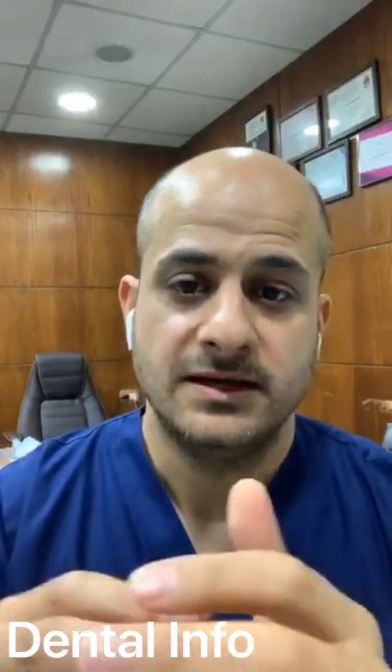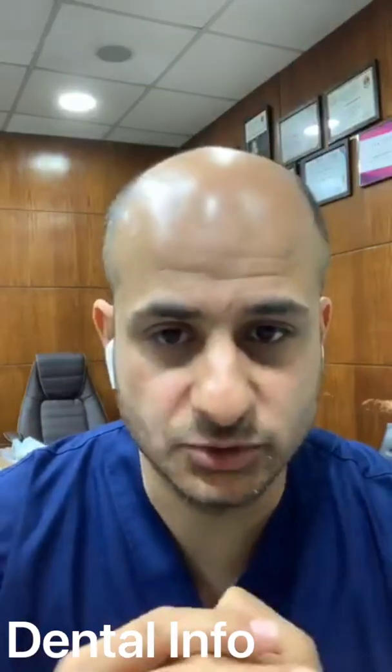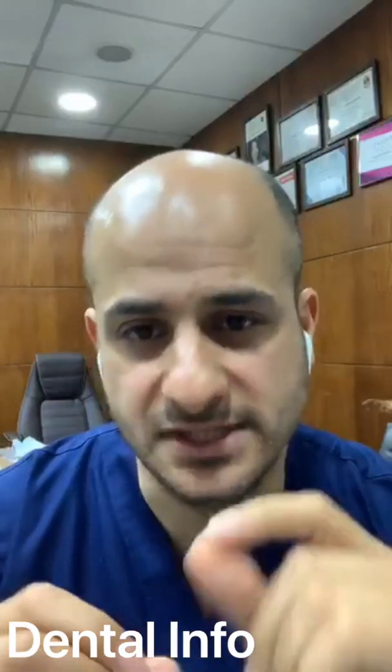Okay. Why is it that sometimes the last file, for example 25 taper 4, does not reach full working length despite having no ledge or blockage, dentine chips, and how to overcome? Okay, Dr. Anoha, this is a very good question. In this situation, you have to go back to your number 10 file and recapitulate and be sure about your patency and irrigate more and more and more, and go like a step back. Take your 15 04 instrument or 15 06 instrument and try to redo the canal preparation. Okay, re-prepare the canal.